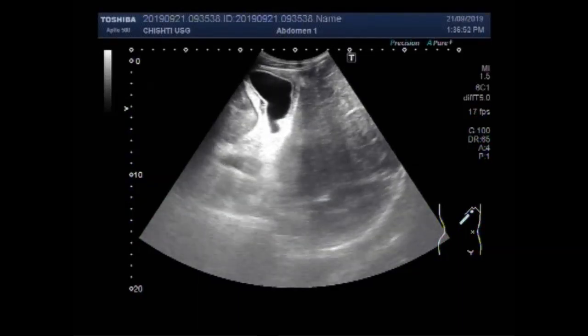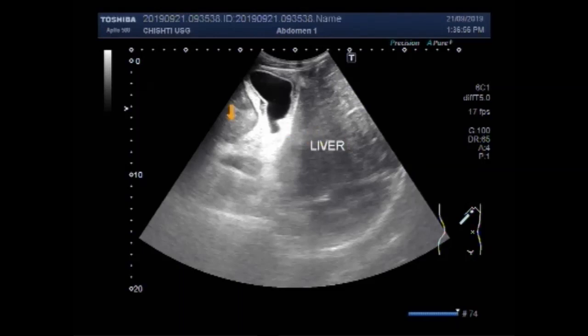Dear viewers, I hope you are all fine. This ultrasound video shows multiple findings in the liver, gallbladder, spleen, and abdomen.